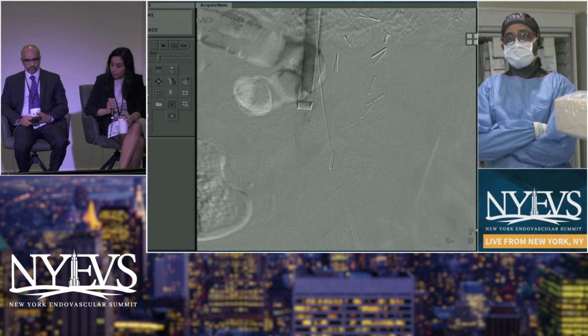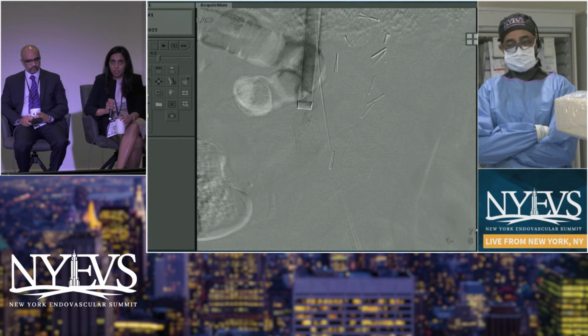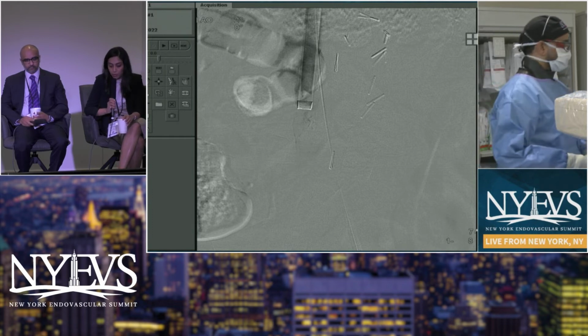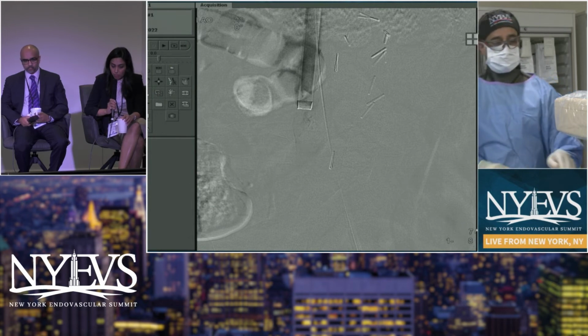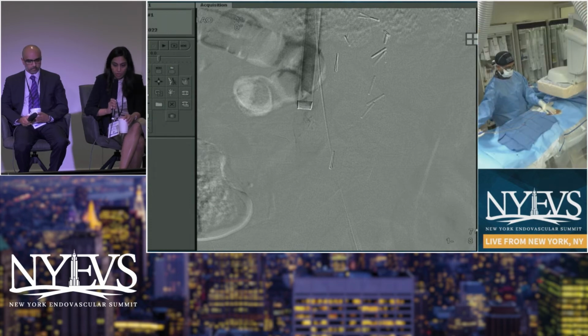I'm just wondering, on the panel here, when you're approaching filters that may have infrarenal or filter-related thrombosis, or filters that have been in, like a nitinol or a Greenfield that's been in for 20 plus years, is there any special imaging, or are they staying postoperatively longer, or are there any measures in place for monitoring these patients or for making sure that you don't have bad outcomes?